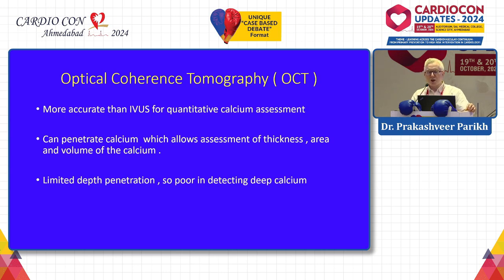OCT is more accurate than IVUS for quantitative calcium assessment because it can penetrate calcium, which allows assessment of thickness, which is very, very important. Thickness of the calcium is very important to select the device. And of course, it gives an idea about the area and volume of the calcium. However, it has limited depth penetration, so it is poor in detecting deep calcium.